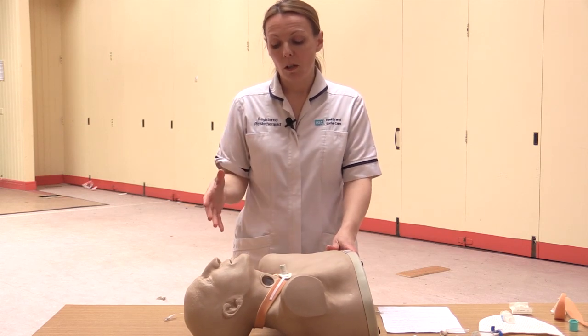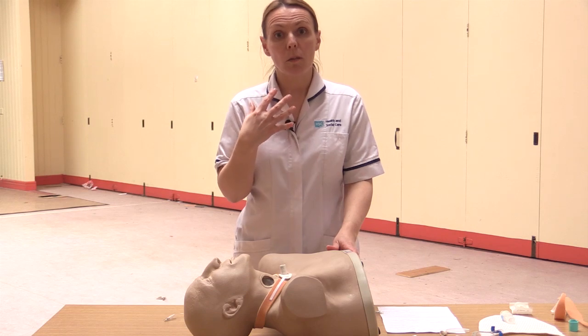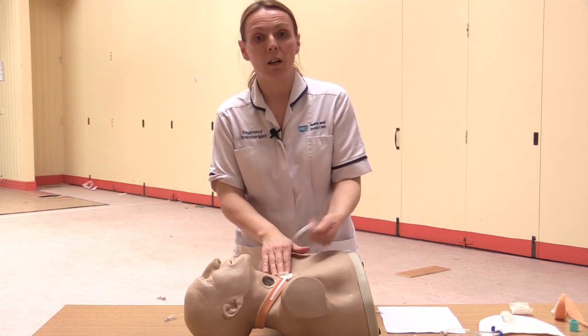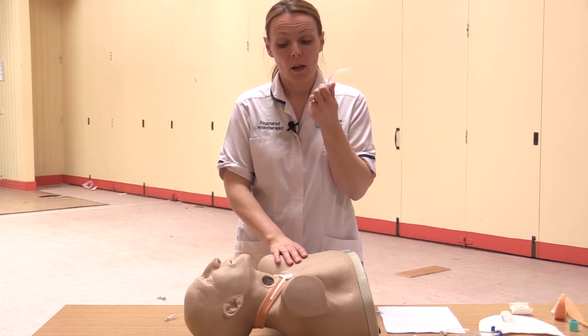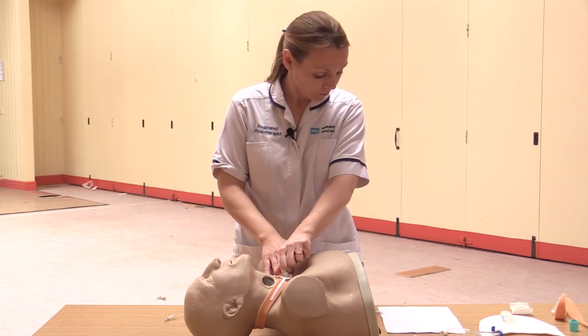Also, in the event of an emergency, if you found the patient and they were having difficulty breathing, the first thing that you would do is take out the inner tube and make sure that it's not blocked, because that might be their only airway.